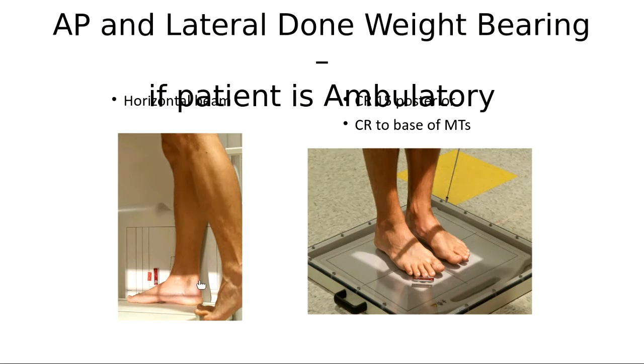And then for the lateral, this particular one looks like they dropped the wall bucky to the floor, and the patient's standing on some kind of step. All right, so it's just horizontal perpendicular beam for the lateral, and the central ray is still to probably medial cuneiform at the base of the third metatarsal.